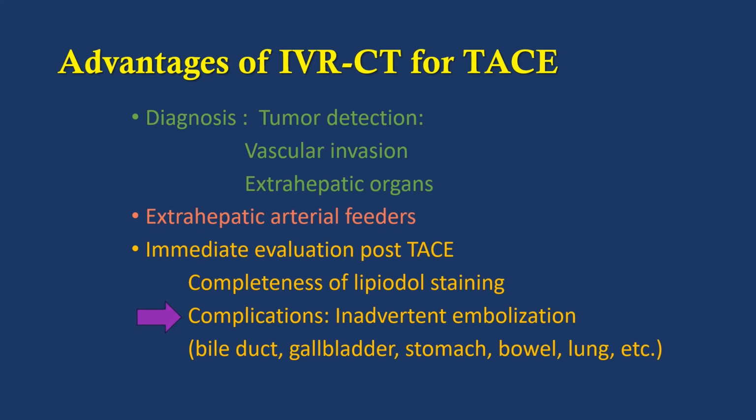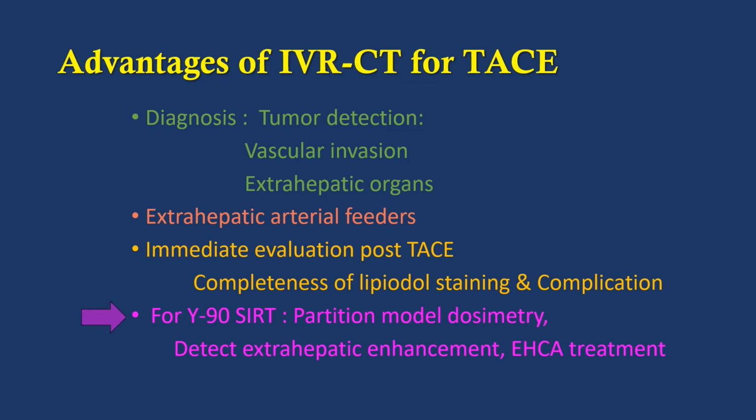IVR-CT can facilitate Y90 radioembolization in many ways. It is well known for partition model dosimetry calculation. It can help detection of extrahepatic enhancement during the workup procedure, and also it can help with extrahepatic collateral artery embolization in advanced cases.